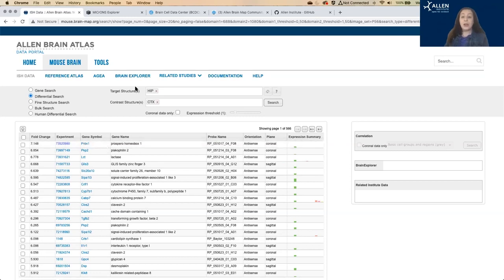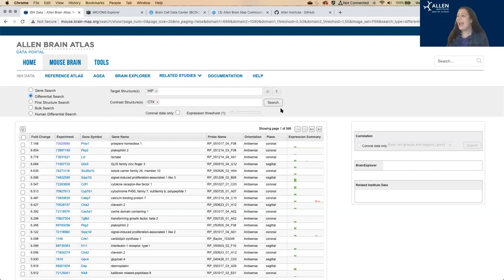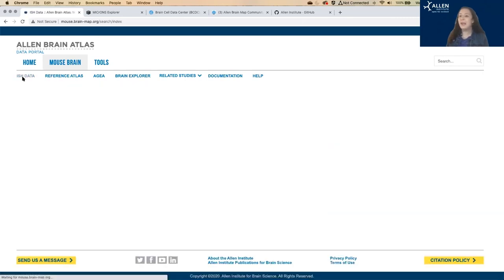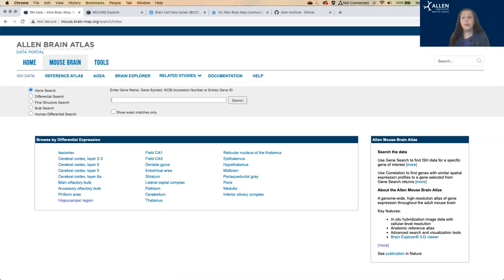You can click on the experiment number here to see more detail about the expression pattern of each gene. I'm going to come back to that in a moment. You can go back to the homepage here to do a new search by clicking on ISH.